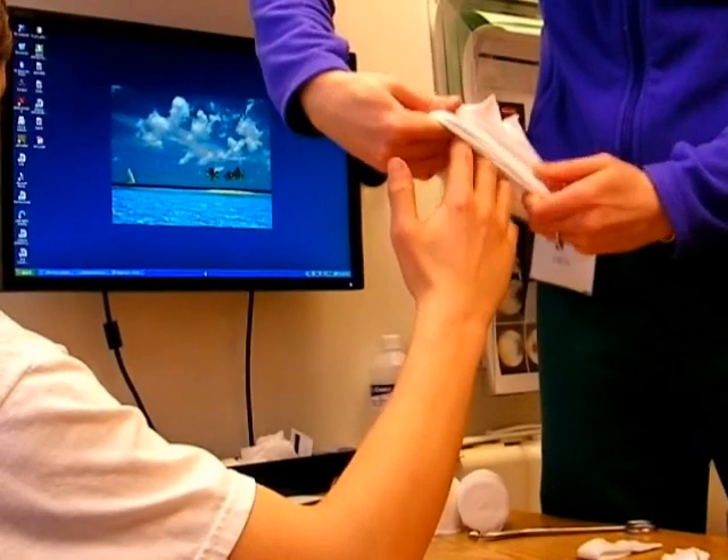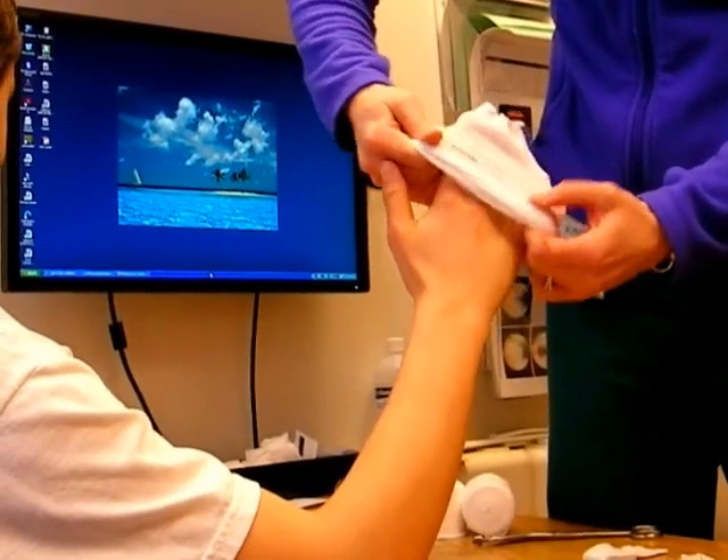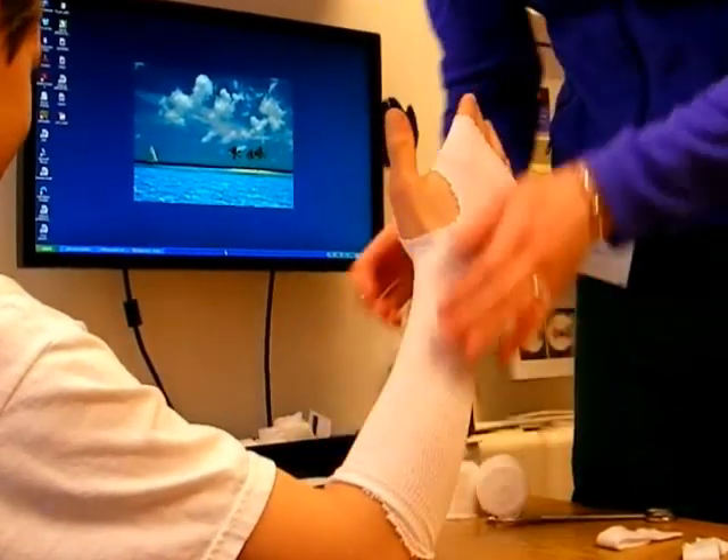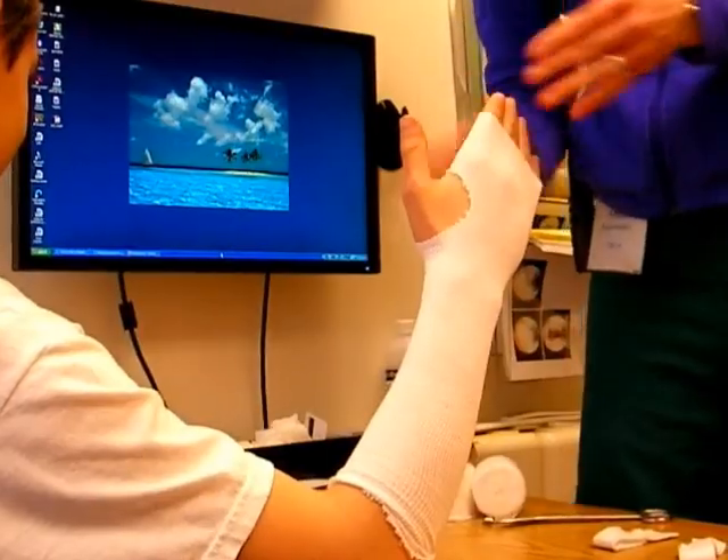Here Amy Kern, one of our medical assistants, shows us how to make an ulnar gutter cast. This is a specific type of cast which is very useful for metacarpal and phalangeal fractures.